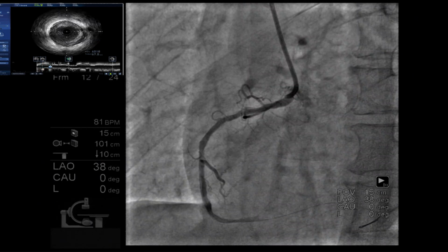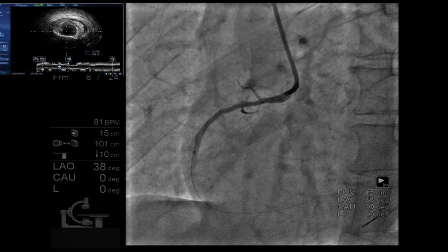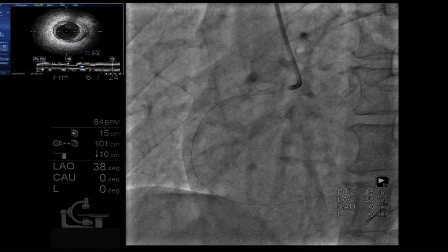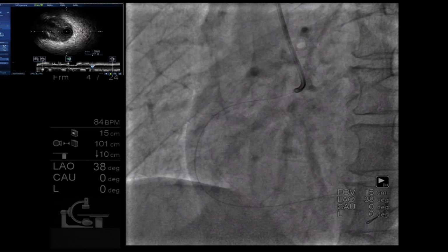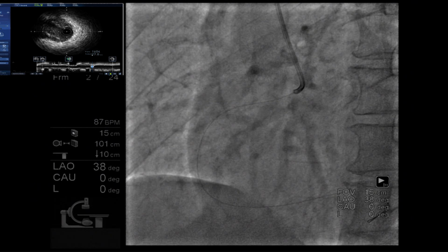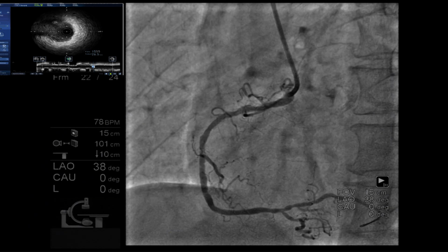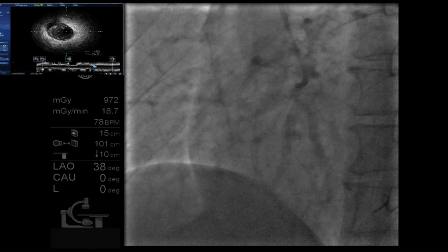So if the stent doesn't track, what's the trick you are planning? What's plan B? I think a Godzilla is one check. Second thing is a short stent, couple of short stents. I think we'll be okay. A stent like Onyx from Medtronic is very, very trackable, even in tortuous, calcified vessels. That's one of my choices. What's this one? Promus Premier 3.5 by 38.